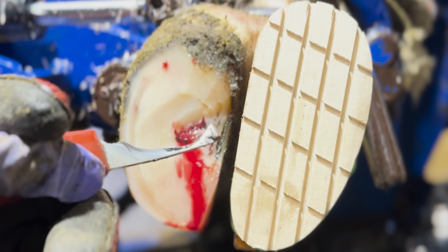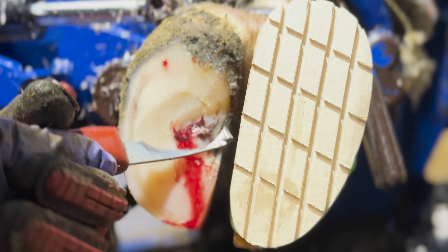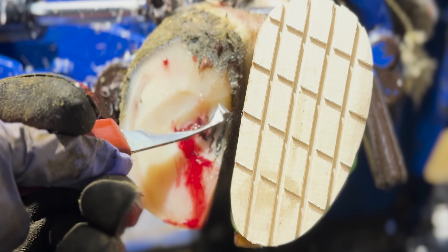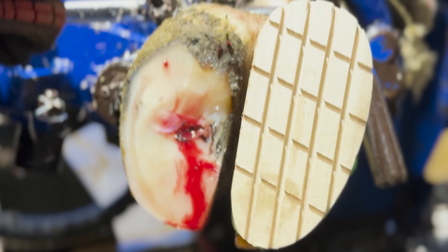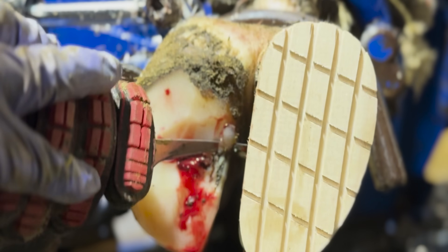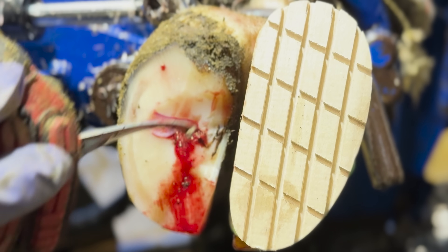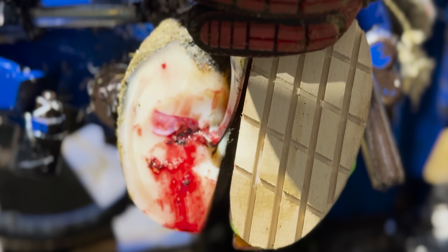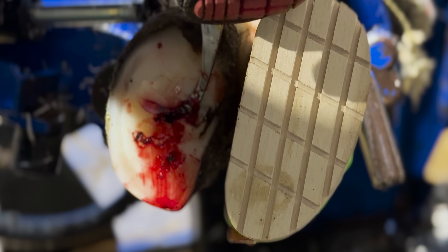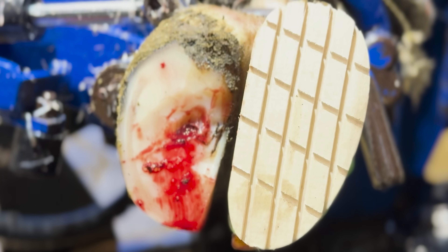We are just going to gradually thin all these margins and trim all this loose excess horn. At the minute I have absolutely no idea where this issue is going to go. I don't know how big this is. I'm pretty sure this is an injury caused by an impact, just judging from where that hole is. I think maybe she'd stepped on a stone, something like that — sort of hard to tell. But you can sort of see along this white line as I'm trimming with my knife that it is going a little bit purple. Maybe there is an impact there. I do not know how this issue started, I don't know what caused it, but I do know we have to fix it.